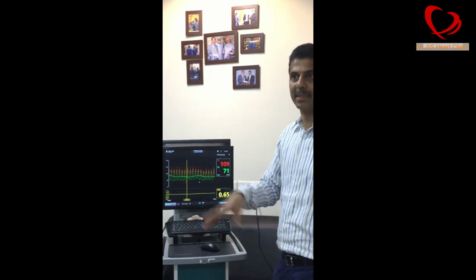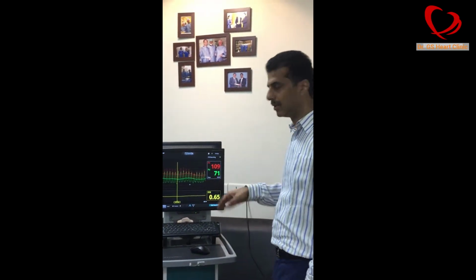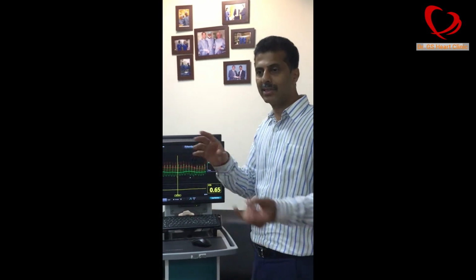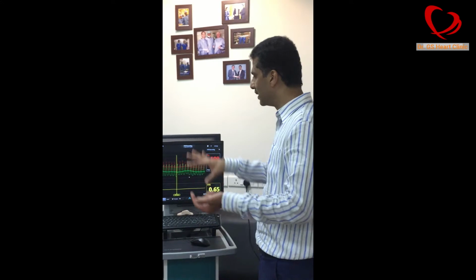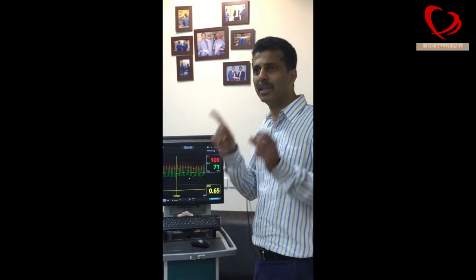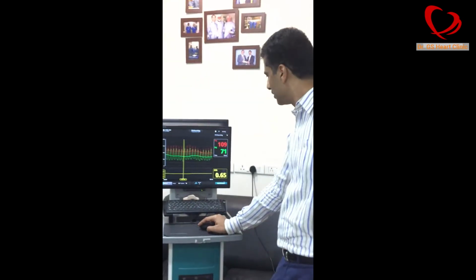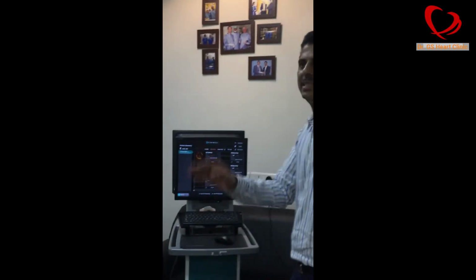So this is a 100% indication to intervene with a stent. But we have confirmed again with an FFR. We have all the evidence now. He has got the angiogram, which is not clear. OCT is very clear, but the flow we didn't measure. FFR gives 100% sure. Once we decide that, then we go ahead and we stent.